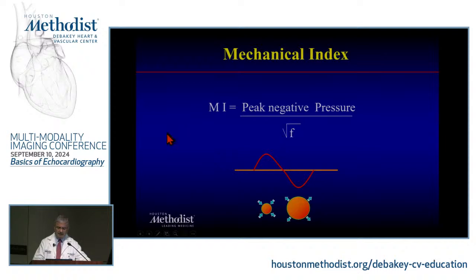But you could destroy them depending on their energy, right? And the destruction, remember, we're talking about microseconds here, is in the negative portion of the phase or pressure curve, right? Because then you expand it so much that the shell bursts basically, etc.